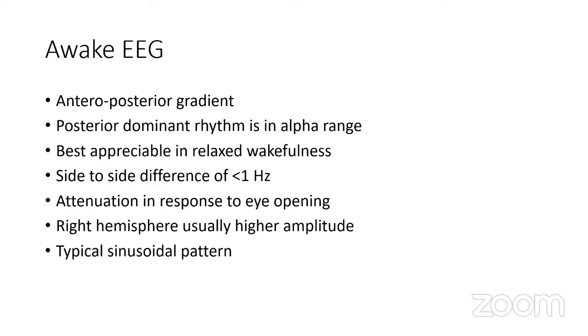Now this posterior dominant rhythm, which we are giving so much importance to, is best appreciable in relaxed wakefulness. So the patient is lying relaxed with his eyes closed and is relaxing well. Only then will we be able to establish and see this posterior dominant rhythm. If the person is not relaxed, this dominant rhythm will not be appreciable.